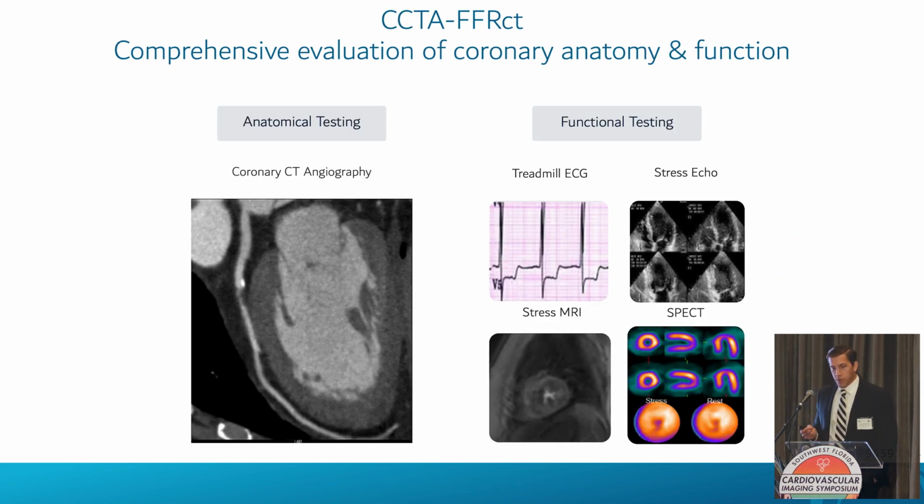So now we have this opportunity to provide a comprehensive evaluation of both coronary anatomy and function with one CT-based imaging session. We're leveraging, again, the sensitivity and negative predictive value of the CT angiography data set. But because of the relatively modest specificity that CTA offers, we weren't always able to confidently call significant stenosis once we get into that moderate to even severe range.